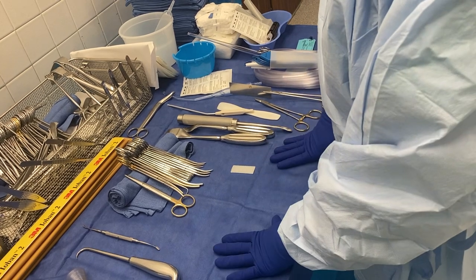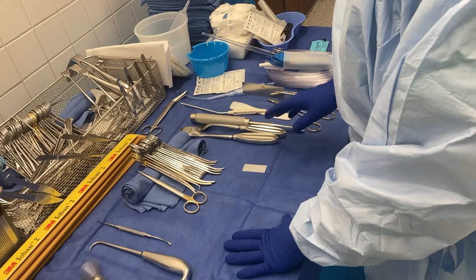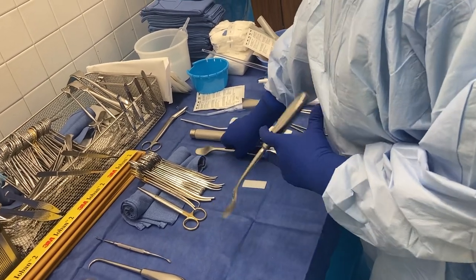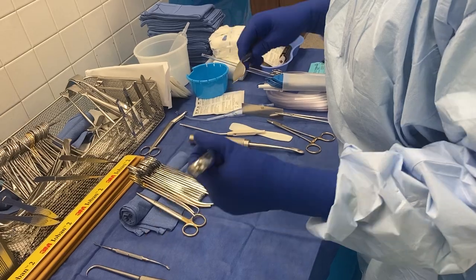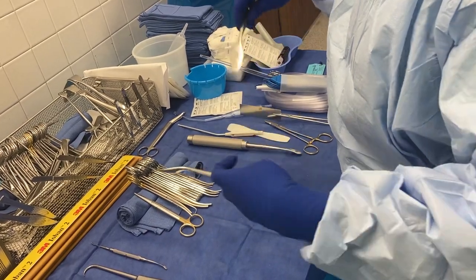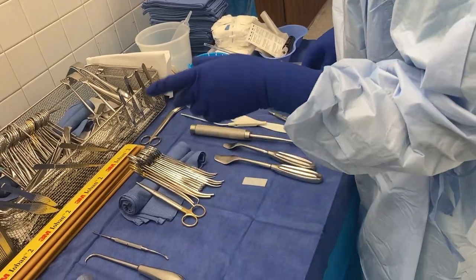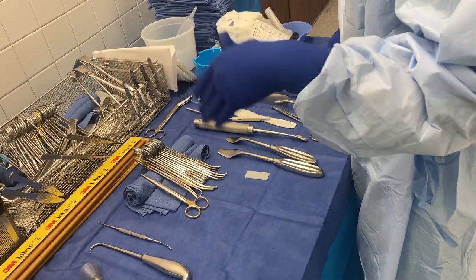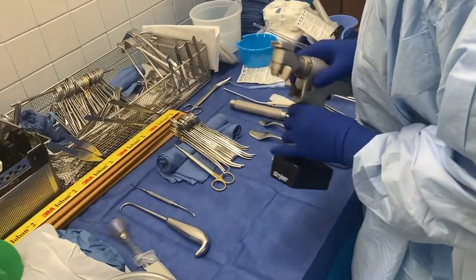Some other things to consider: you want to make sure that we're protecting the arteries as best as we can. We use chandlers to basically wrap around whatever bone we're amputating to protect the vessels underneath it. They'll use two of these in combination when doing the cutting of the bone. We'll use an oscillating saw.